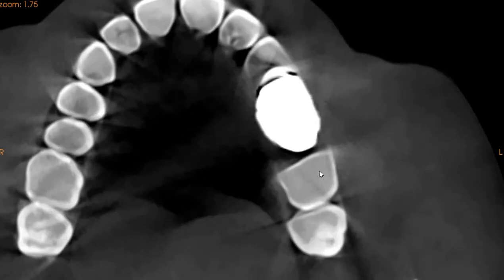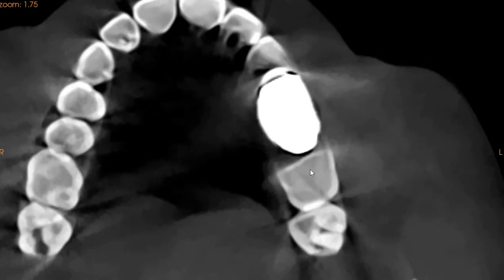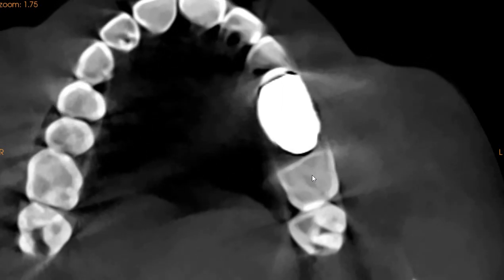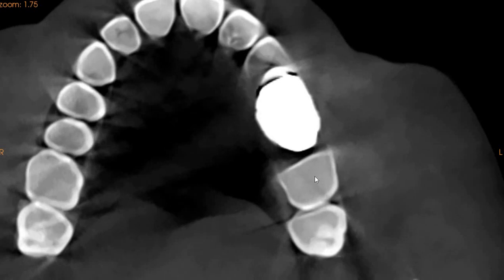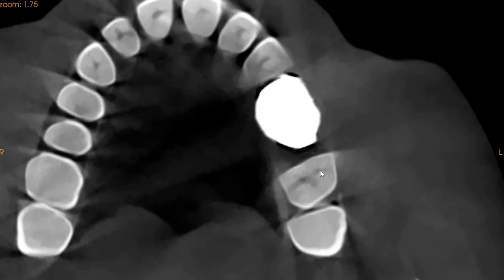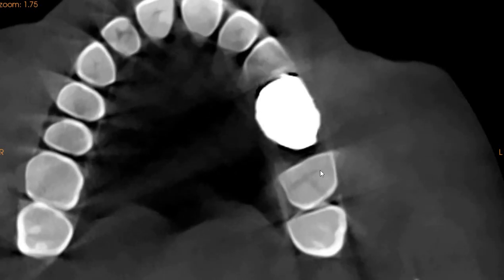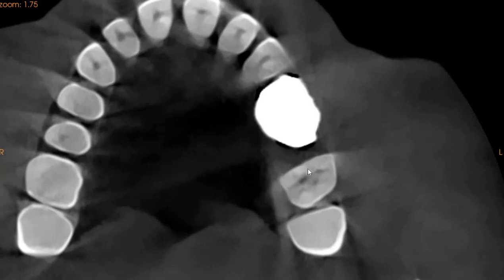This is where the lesion is — right there. It gets slightly closer to the pulp, so it could be the reason for her pain, but clinical correlation is definitely advised. Thank you very much.